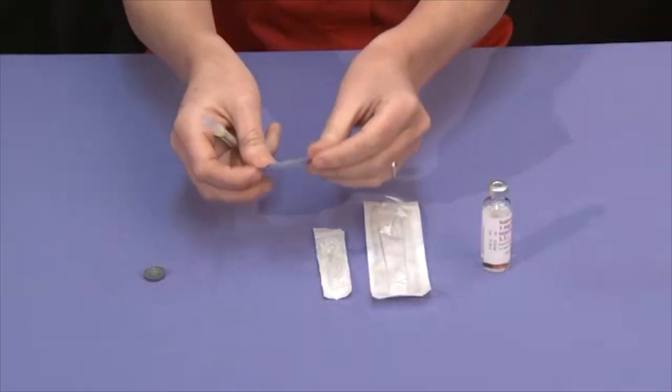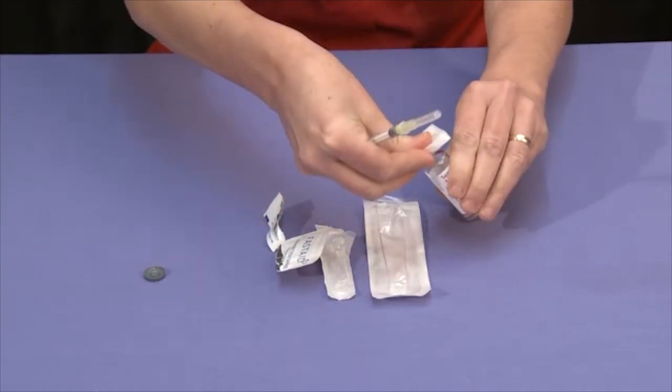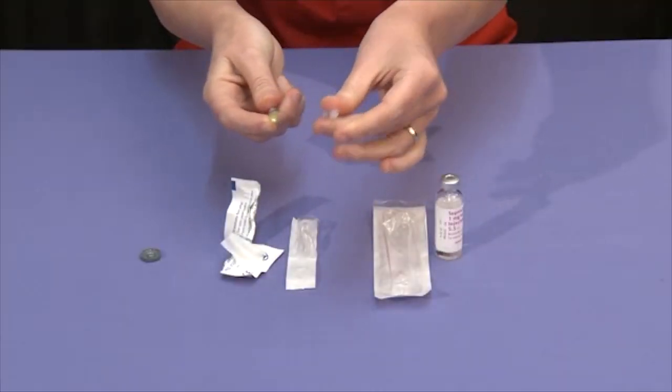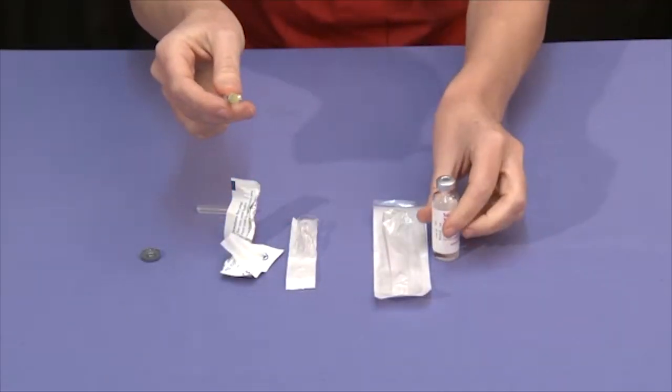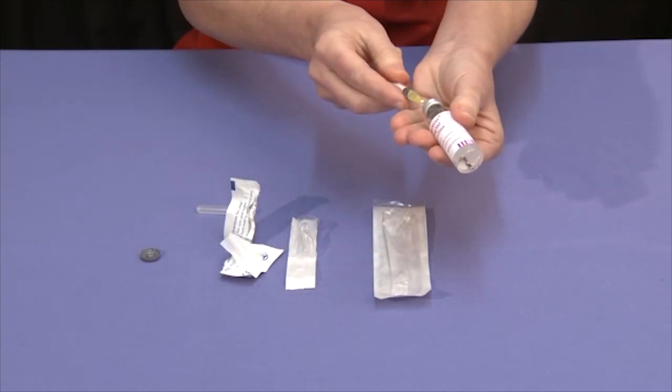Then, using the alcohol swab, wipe the rubber top of the vial. Remove the protective cover from the needle and, inverting the Bucerulin vial, push the needle through the rubber seal.